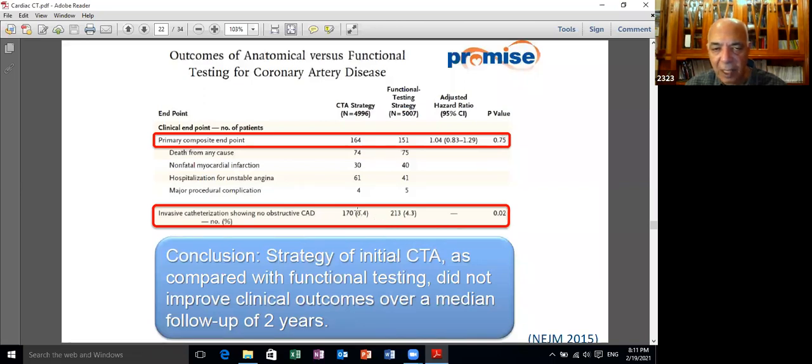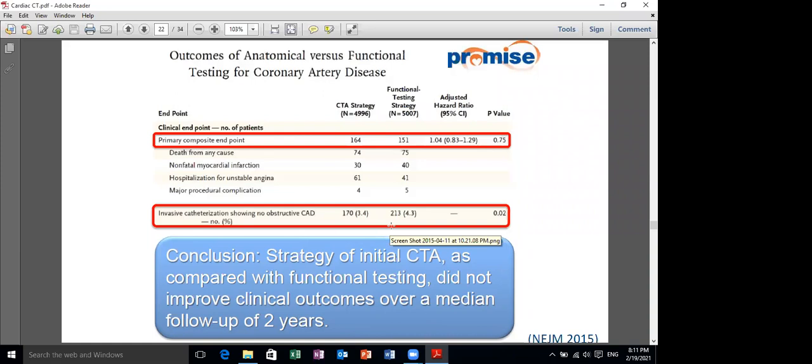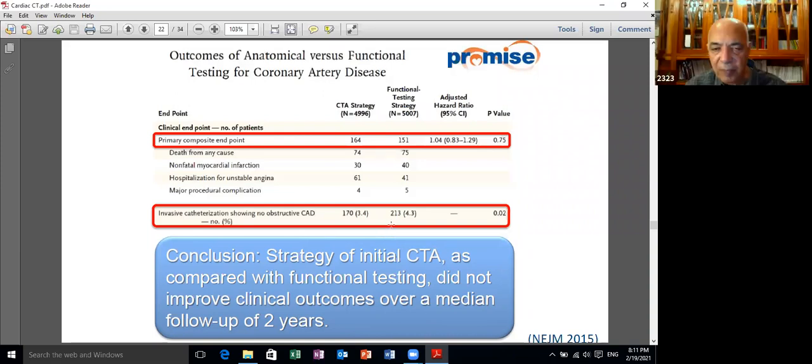The reason for that is that with CT, you will diagnose ischemia if there is an obstruction above 50%, particularly above 70%. But now we know that there is something called INOCA, which is ischemia with no obstructive coronary artery disease. Sometimes the presence of just plaques, particularly if the plaques are numerous, four or more, even non-obstructive, can produce ischemic manifestations exactly equal to the presence of an obstructive plaque. So we no longer disregard the plethora of non-obstructive plaques.